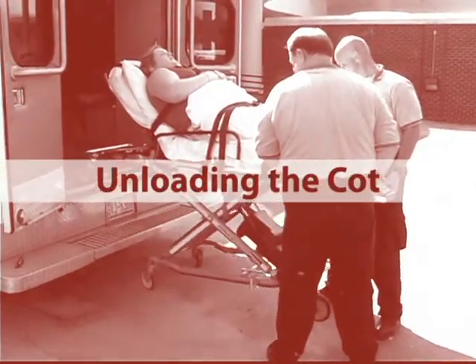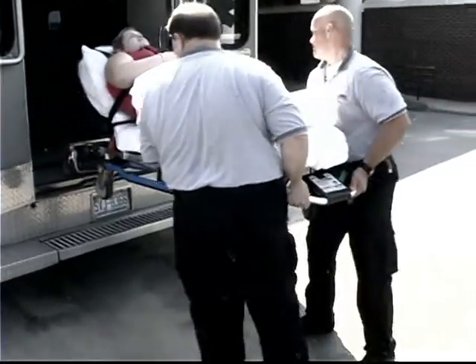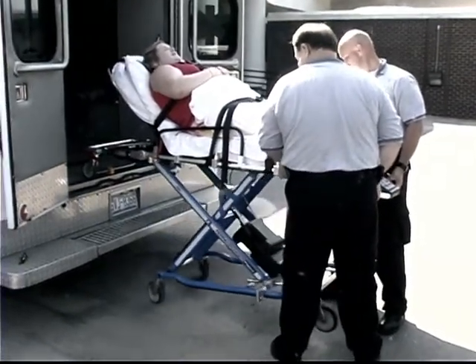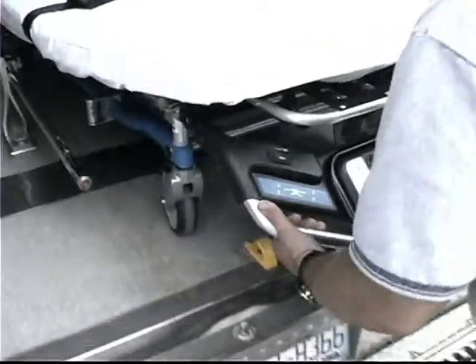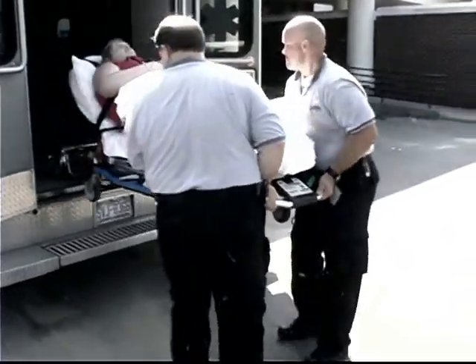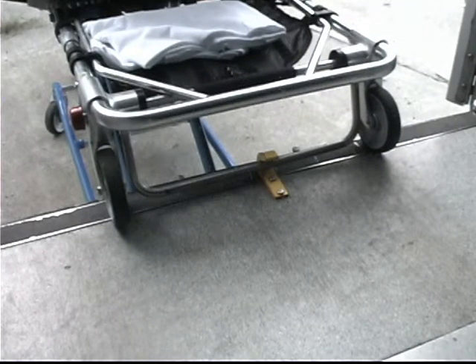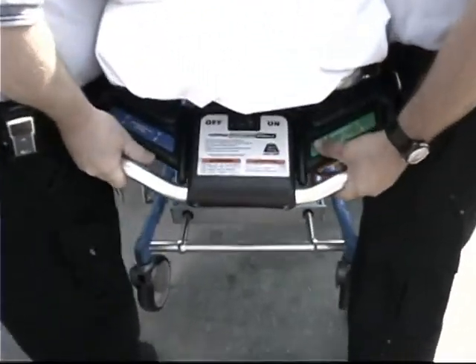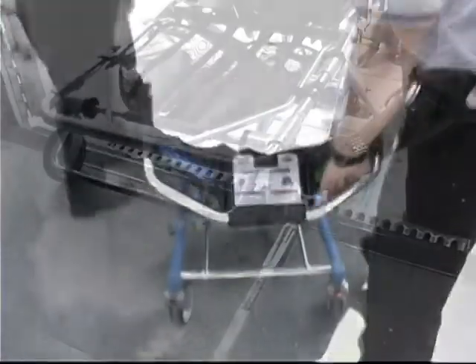Unloading the cot. Unloading a cot with a patient on it requires a minimum of two trained operators working together. Both operators may stand at the foot end corners of the cot while unloading it. To unload the cot, raise the ambulance folding bumper if present and release the cot from the cot fastener. Both operators then work together to pull the cot out of the ambulance until the safety hook on the ambulance floor catches the safety bar on the cot. Keep the cot raised and level with the ambulance floor. The control operator presses the green raise unload touchpad to extend the legs and releases the touchpad when the wheels touch the ground and the cot is high enough to be released from the safety hook.